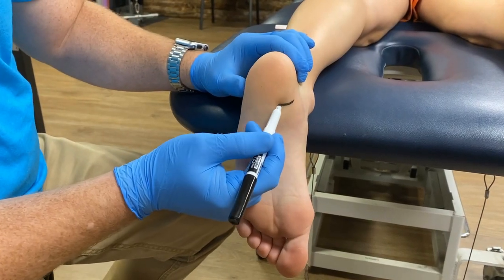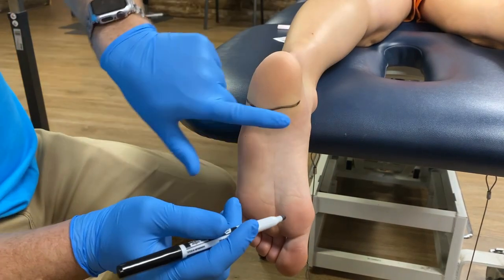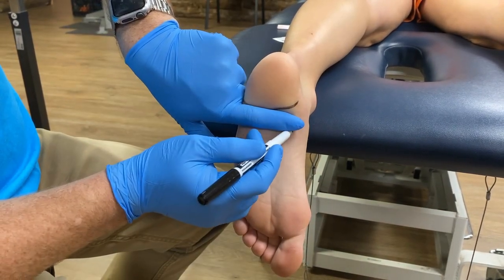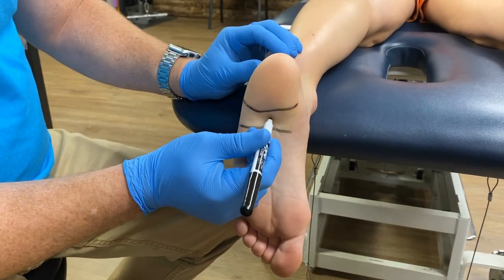First, we'll mark the bottom of her fat pad, which is basically at her calcaneal tubercles. Then we'll mark one finger width below her fat pad, and this will give us a safe spot to identify an area to perform dry needling.